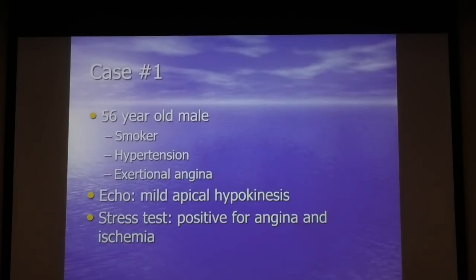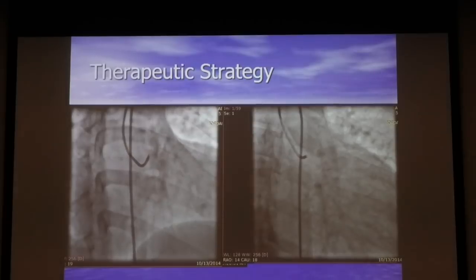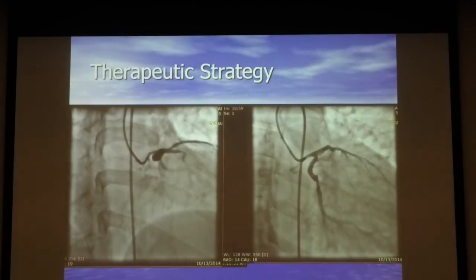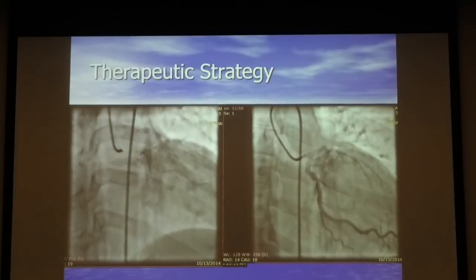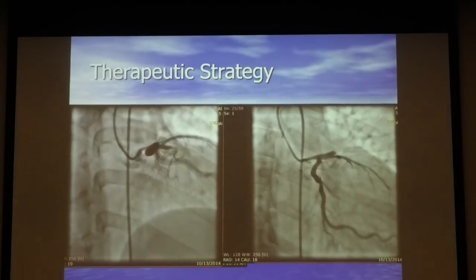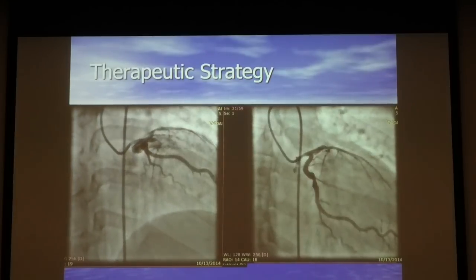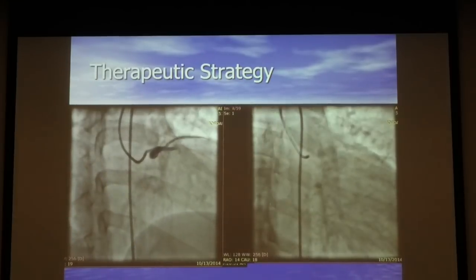LAD. يعني احنا لما سوينا الفحوصات وطلع من العيادة توقعنا انه يكون LAD. طلع شو طلع لنا. This is the first angiogram. شو رأيك؟ ما طلش LAD. طيب شو تسوي؟ Tight left main, total LAD. LAD متوقعة. Left main اجتنا على البيعة.